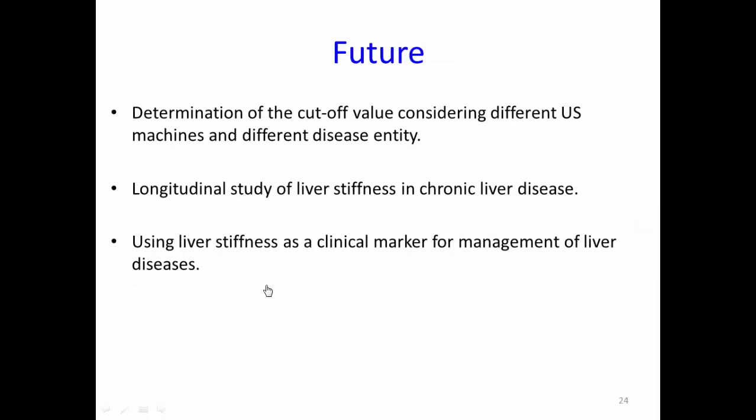So for the future, determination of the cutoff value is another issue because in the present state, the liver stiffness measured by the different machines is not interchangeable.